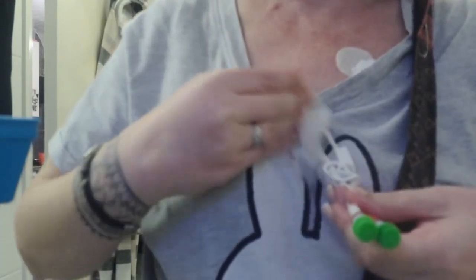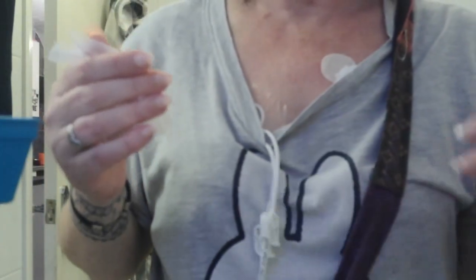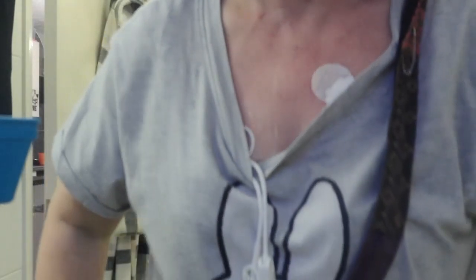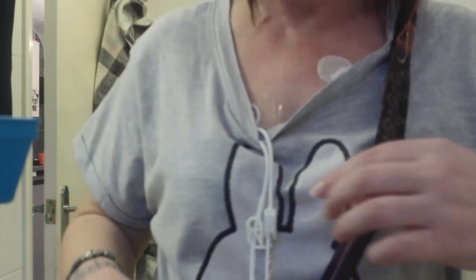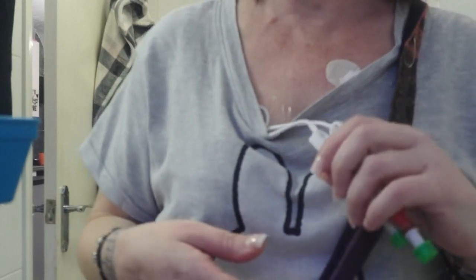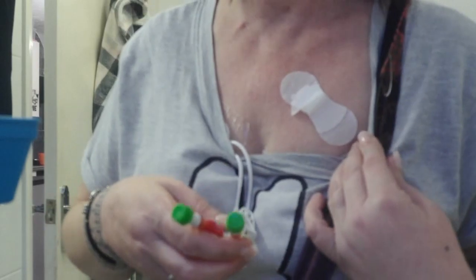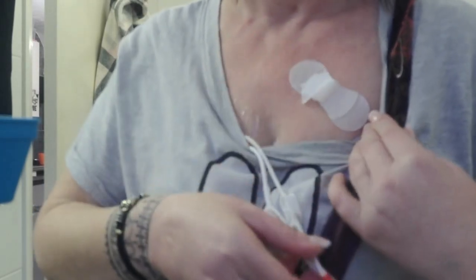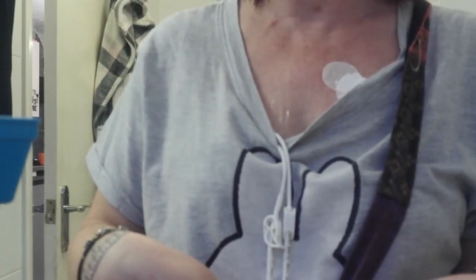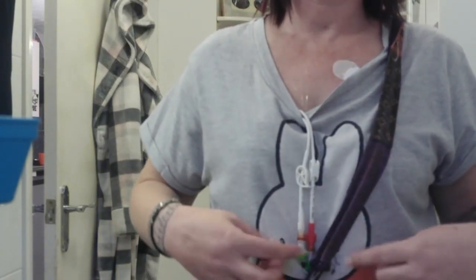So I don't leave my lines dangling at all, because if I did, I'd forget and they would be dangling out and Binky would find them without a shadow of a doubt. They do say though that they should be out so that they're not against your skin because of bacteria. So I have them in a grip lock here, and I put them like that, but they're still underneath my top. Plus if I have them hanging down underneath, which they're saying they're not meant to because they're against your skin, then they're very long.